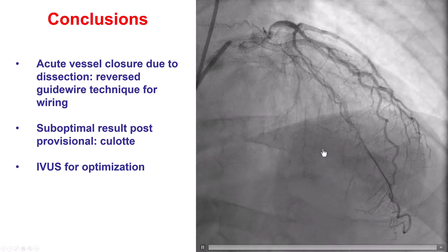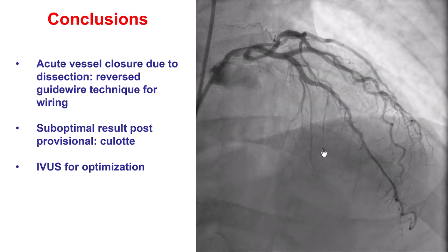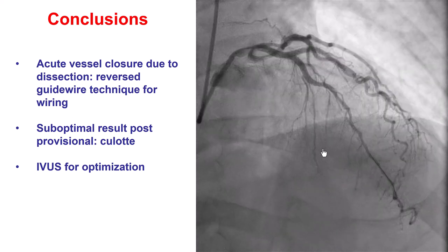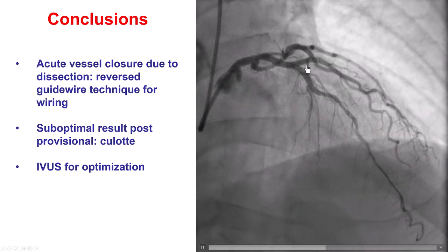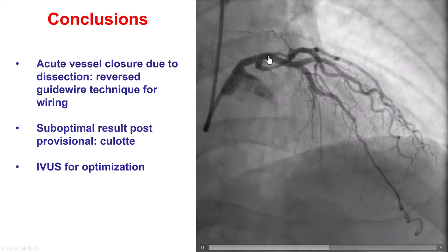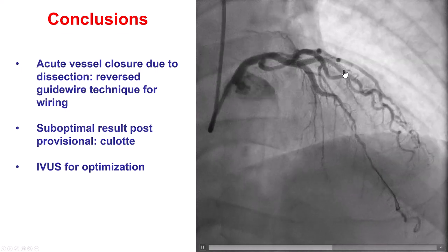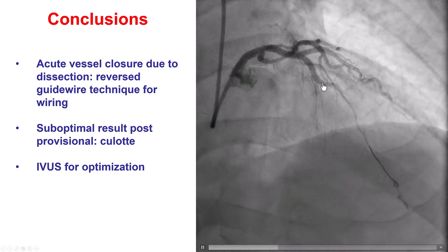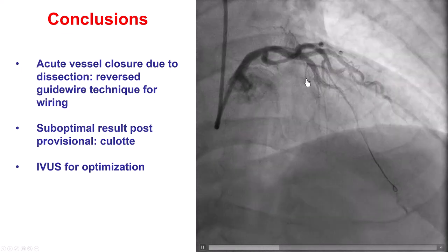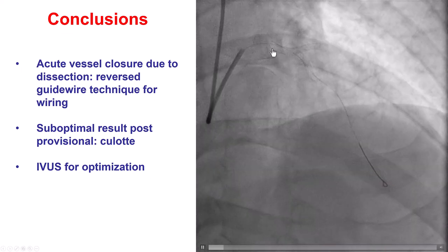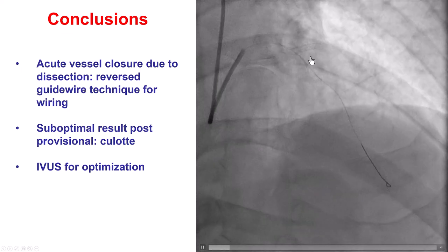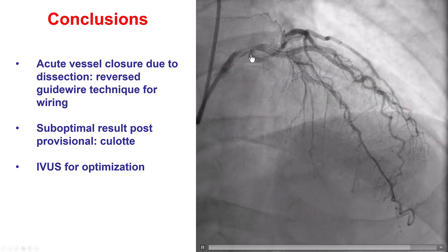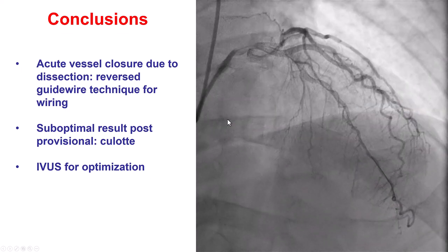In summary, this case illustrates several important lessons. The first is how the reversed guidewire technique can help salvage a case of acute vessel closure. In this patient, we had difficulty getting a wire into the LAD and likely dissected it and could not advance the guidewire. By advancing a reversed polymer-jacketed Sion Black guidewire into the diagonal and then pulling it back slowly, we were able to wire into the LAD — that was the key moment that turned the case into a success. After that, we tried provisional, which did not work, so we used the culotte technique since the side branch and main vessel were of similar size. And like every complex PCI, we used intravascular imaging with IVUS for stent optimization.